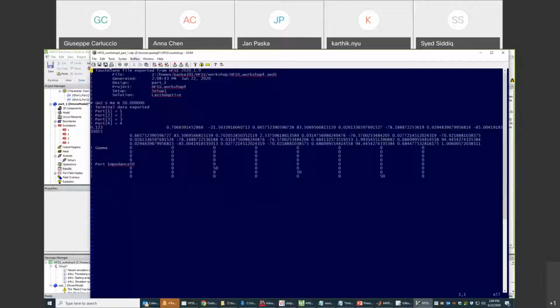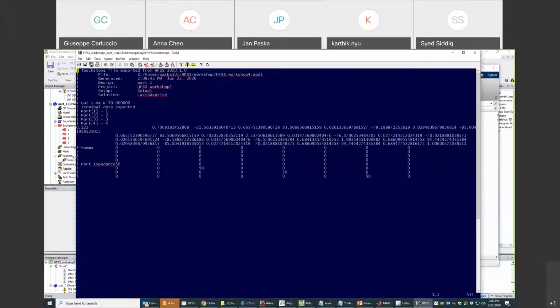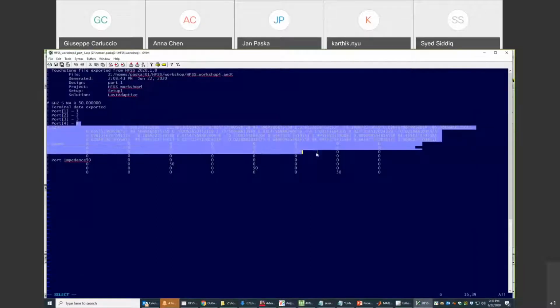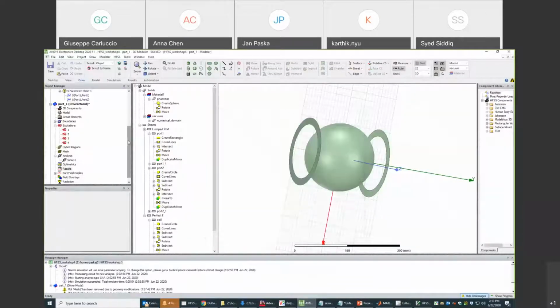So yeah, this is how the S matrix looks like. We have amplitude and phase. So yeah, it's a complicated matrix, and we want to match that. I guess I could just try to copy this into MATLAB, and then we can have a look and plot it. But yeah, I don't want to do that. It will take some time. So yeah, it's a matrix. It has complex values in each component. It's a 4x4 matrix, and then we can use co-simulation to try to match that.